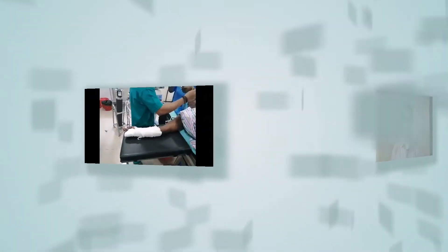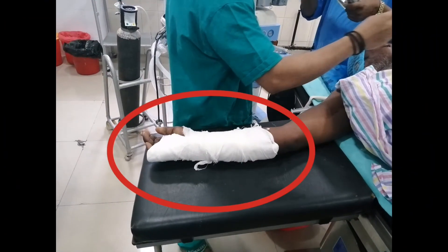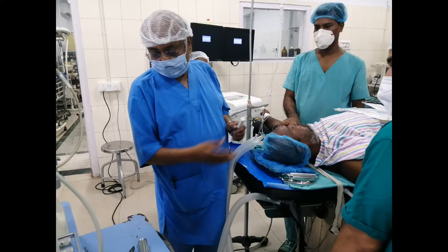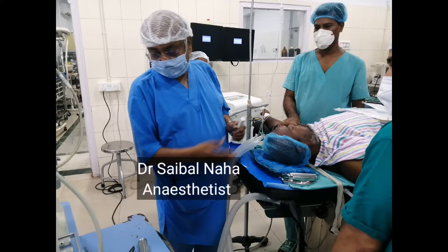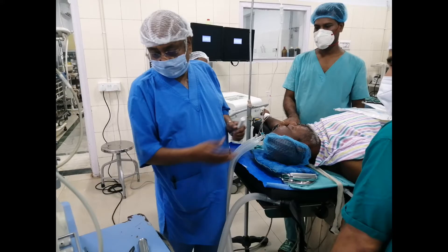So let's see for ourselves what happens during general anesthesia. This is an orthopedic patient whose hand is going to be operated. Welcome Dr. Naha, who is going to anesthetize this patient today.